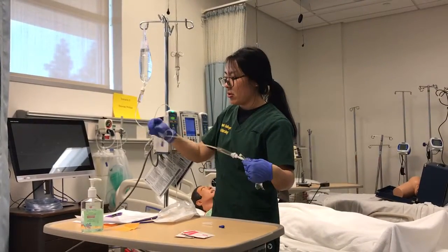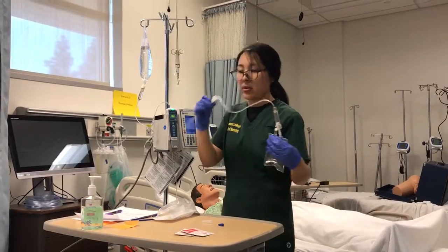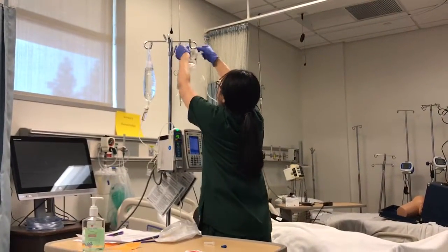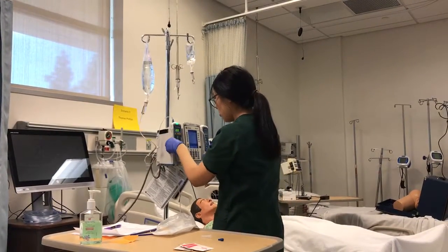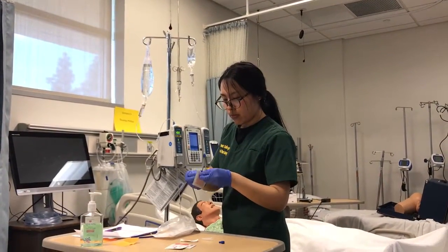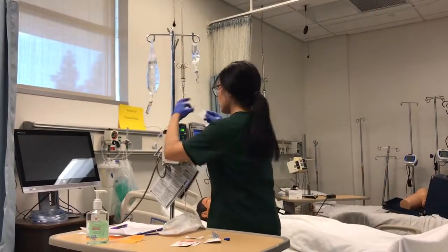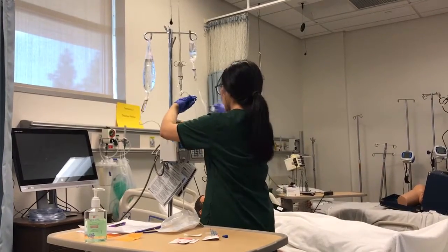Here, I need to make sure this tubing is clamped before I hang it. So this one is closed. I go ahead and hang it here, get it ready. Then I will pass the primary bag. After this, get an alcohol swab. Here, get the secondary ready.